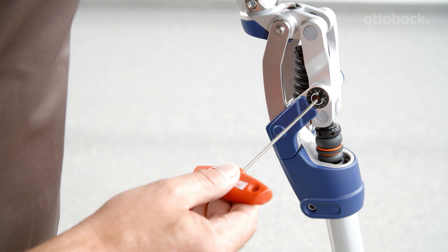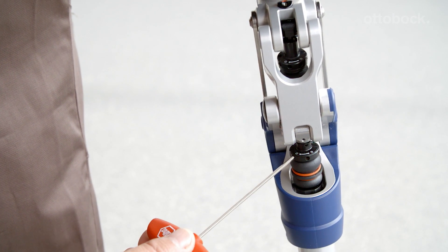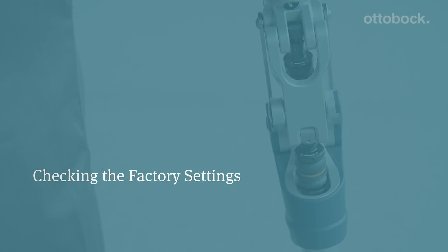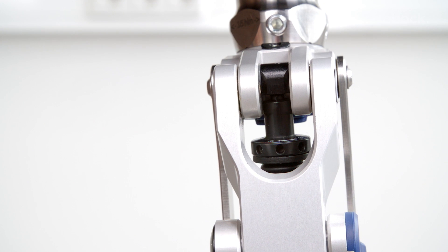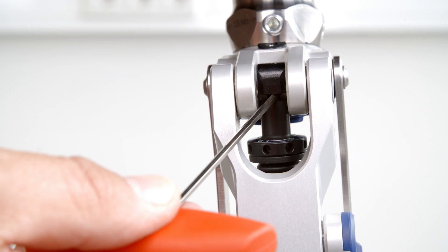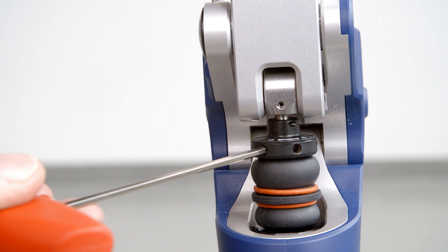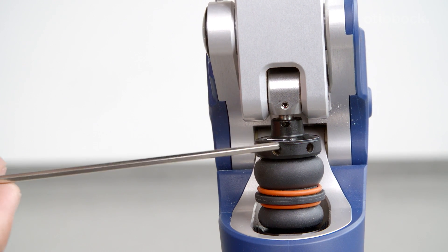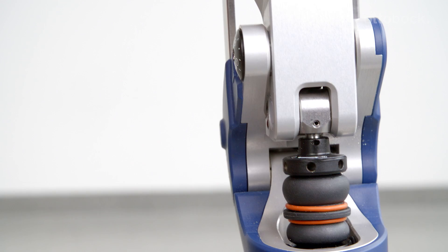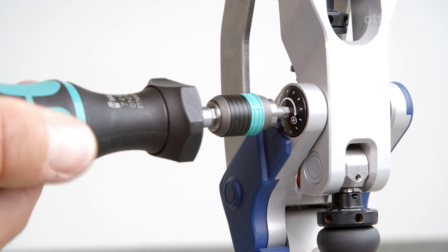The following adjustments can be made with Pheon: swing phase friction, the ergonomically balanced stride (EBS), and the extension assist. Please check the factory settings before fitting the user. The factory settings of the extension assist need to be restored so that a gap of approximately 1.5 millimeters can be seen above the adjustment ring. For the EBS unit, the gap above the adjustment ring should be approximately 3 millimeters. Swing phase friction should be pre-tensioned to 0.5 newton meter using a suitable torque wrench.